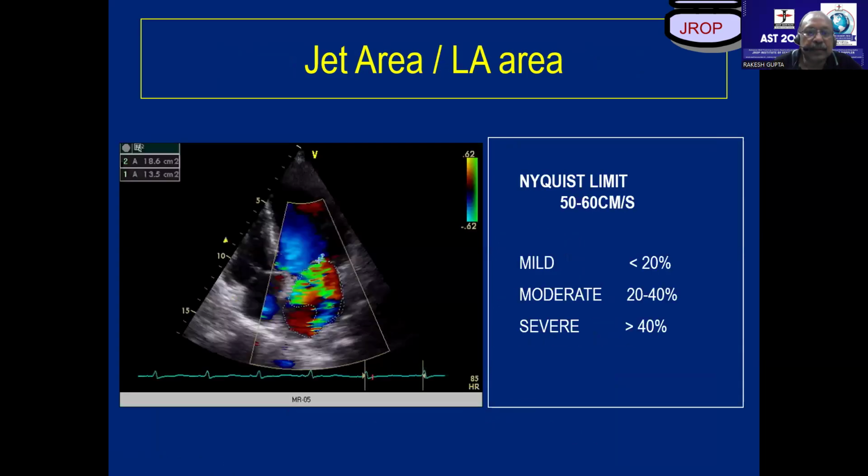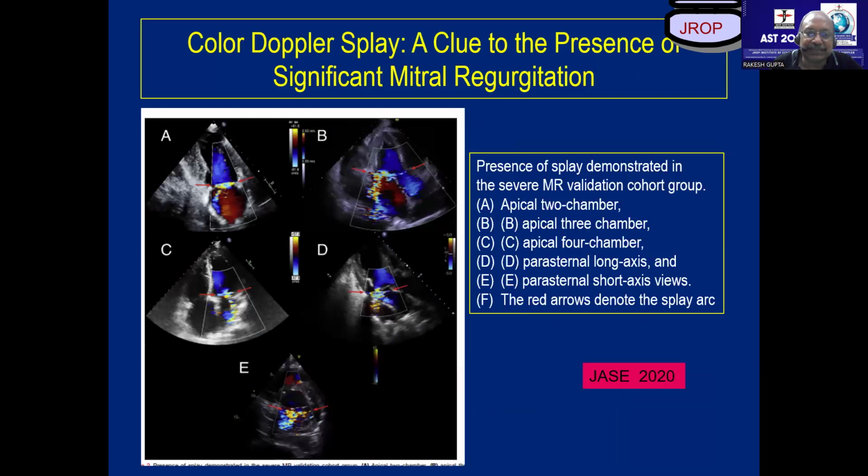The flow convergence, PISA, same thing, sir. Yeah, flow convergence PISA is the same.